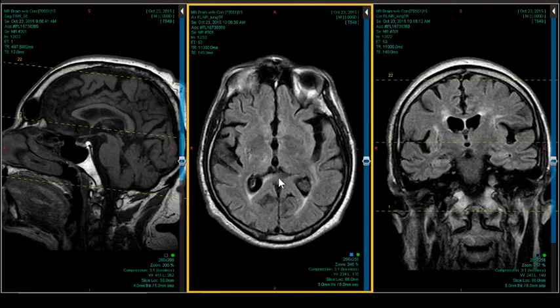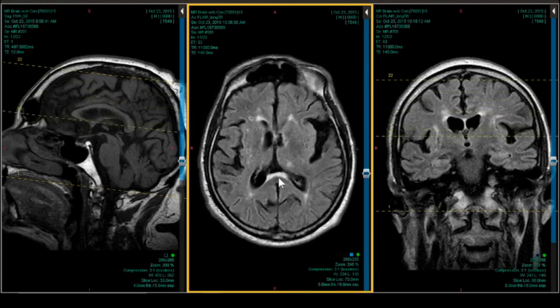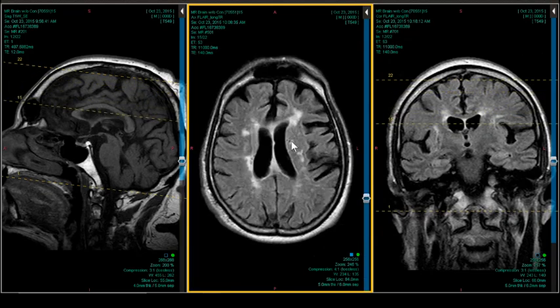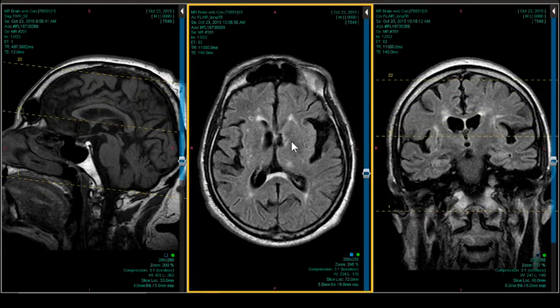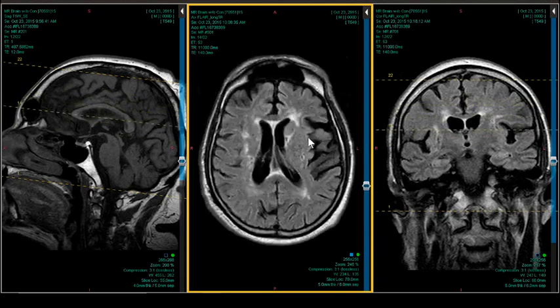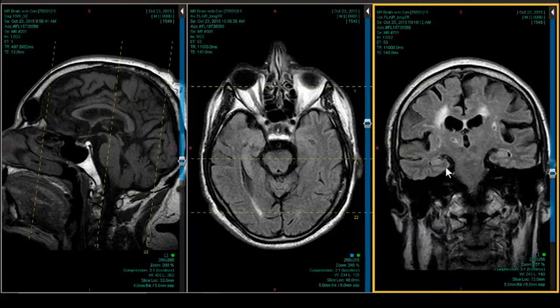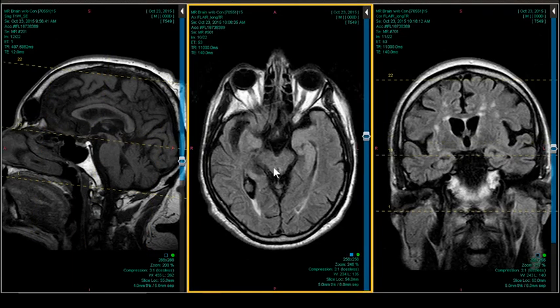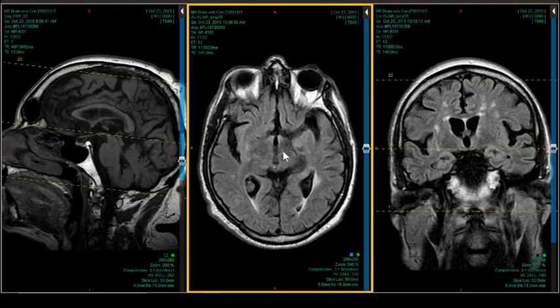Now, so we've got vascular disease, but is that the whole problem? So the ventricles are big, but is it NPH? I don't think so, right? There's no sulcal effacement. There's no transependymal spread, okay? So that's some of the things we can answer. I mean, you've got temporal pattern atrophy for sure, probably, although the hippocampi are not that bad, right? So we're kind of working on, here's our brain iron, okay?